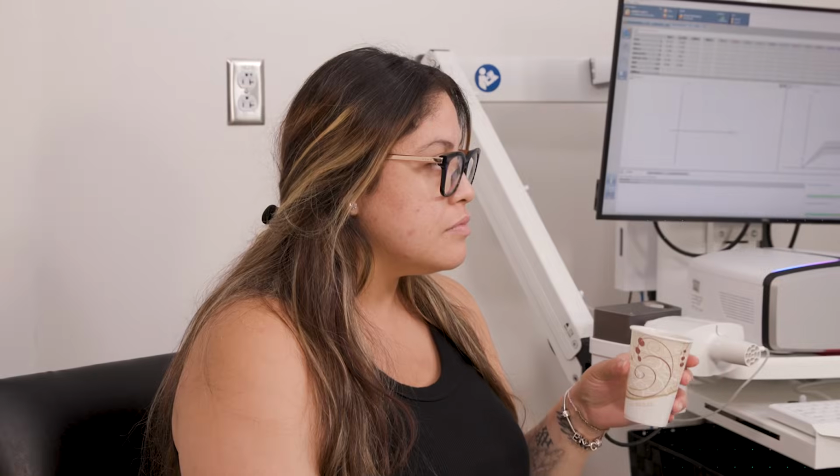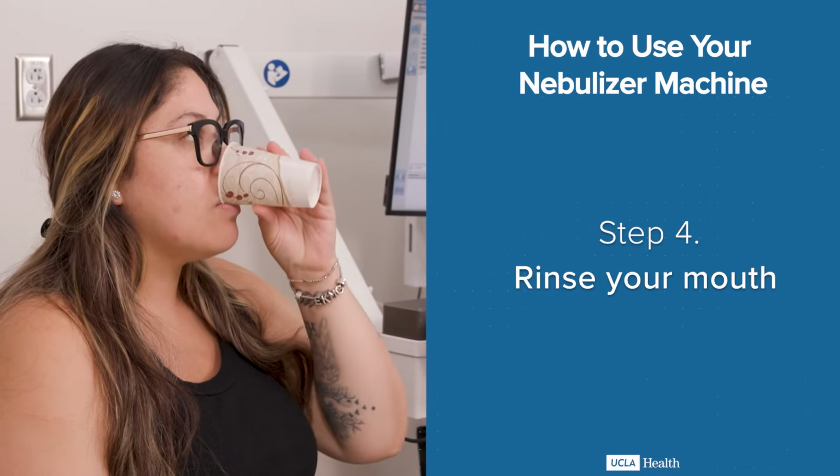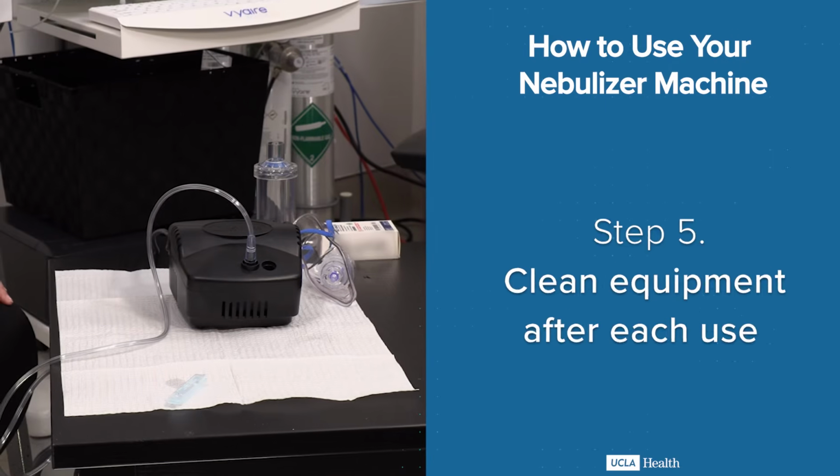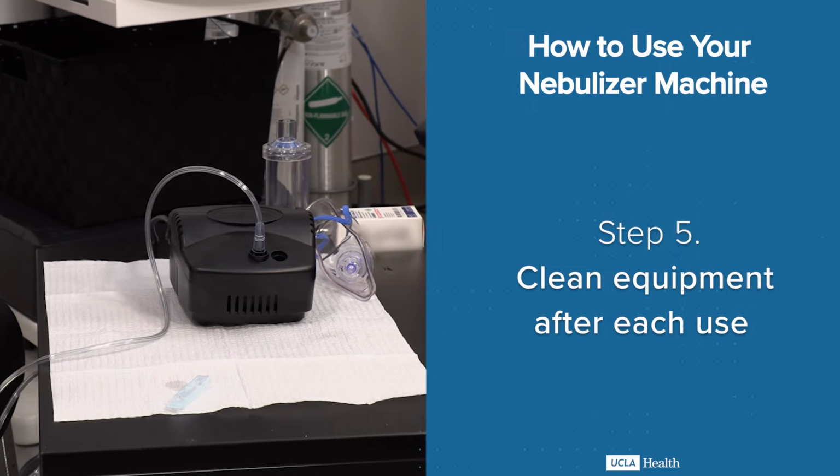Step 4. Rinse your mouth if your nebulized medication includes an inhaled steroid. Step 5. Remember to regularly clean your equipment with soap and water.